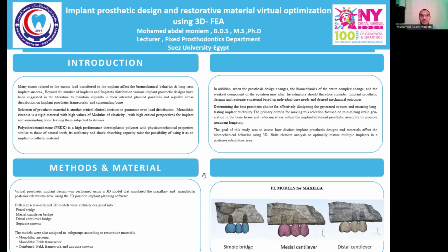Today, I'll be presenting a scientific poster named Implant Prosthetic Design and Restorative Material Virtual Optimization using 3D Finite Element Analysis. As an introduction to this topic, many issues are related to the excess load transferred to the implant, which affects the biomechanical behavior and long-term longevity.